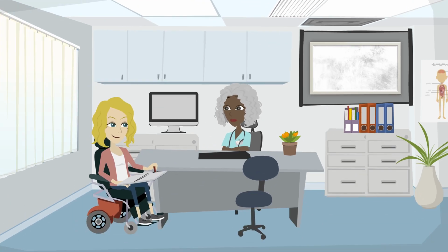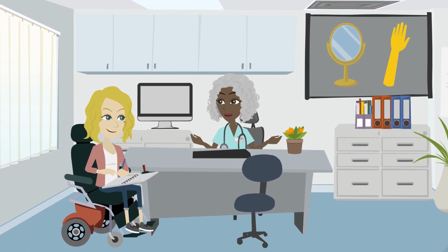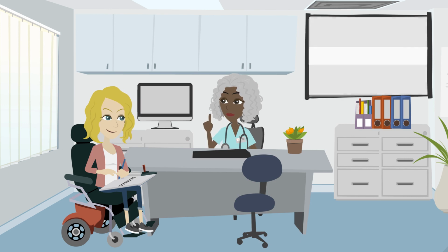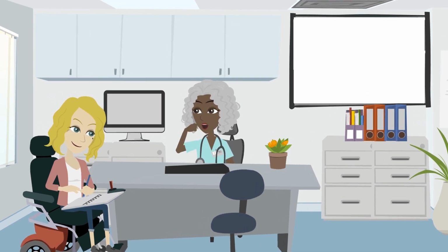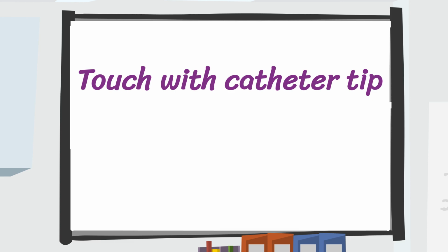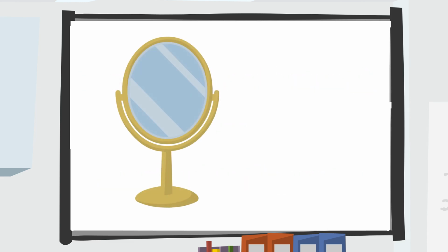So Sam, there are two approaches to getting familiar and comfortable with your own anatomy: through touch or by using a mirror. Some people start by using both, and then graduate to relying only on one or the other. When familiarizing yourself by touch, there are two approaches you can use. One is you feel the touch of the catheter on the urethra, the opening where you'll insert the catheter. The other approach, depending on the degree of feeling you have in your fingers, is to touch the spot you'd insert the catheter tip. Start first by using a mirror to help you develop the ability to use touch.